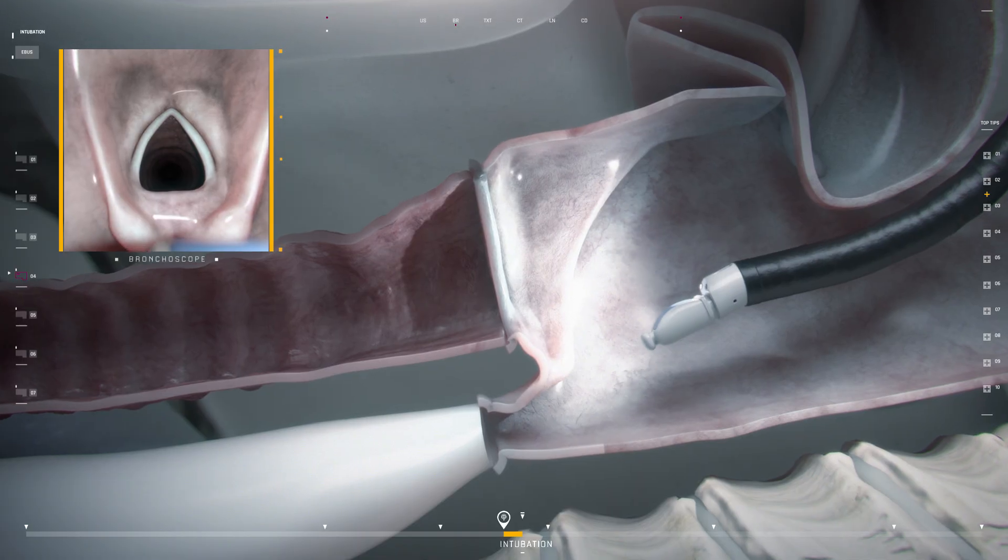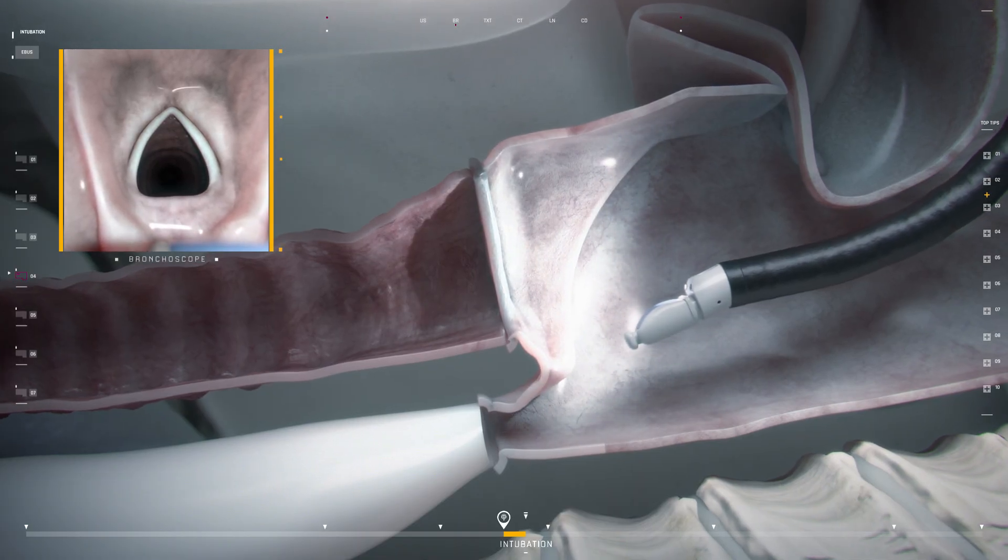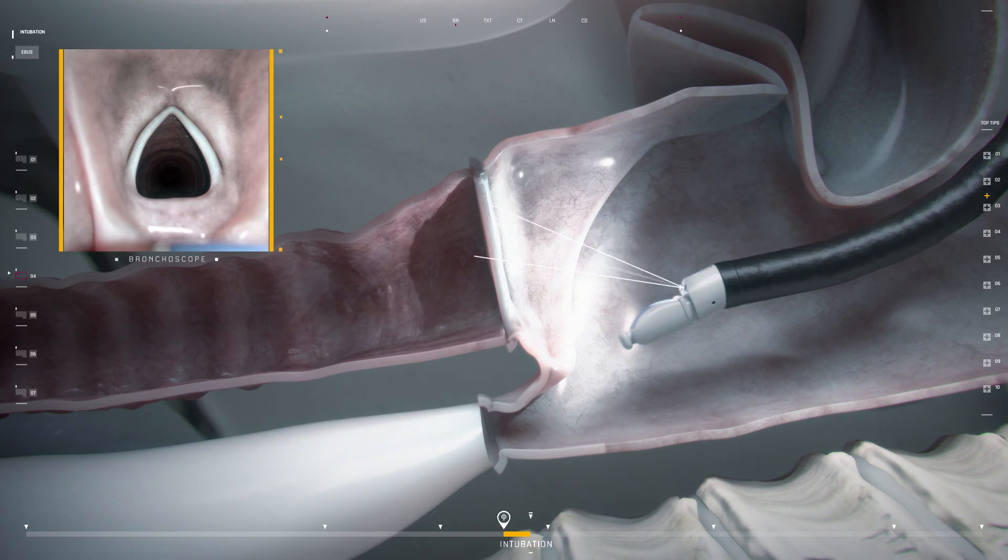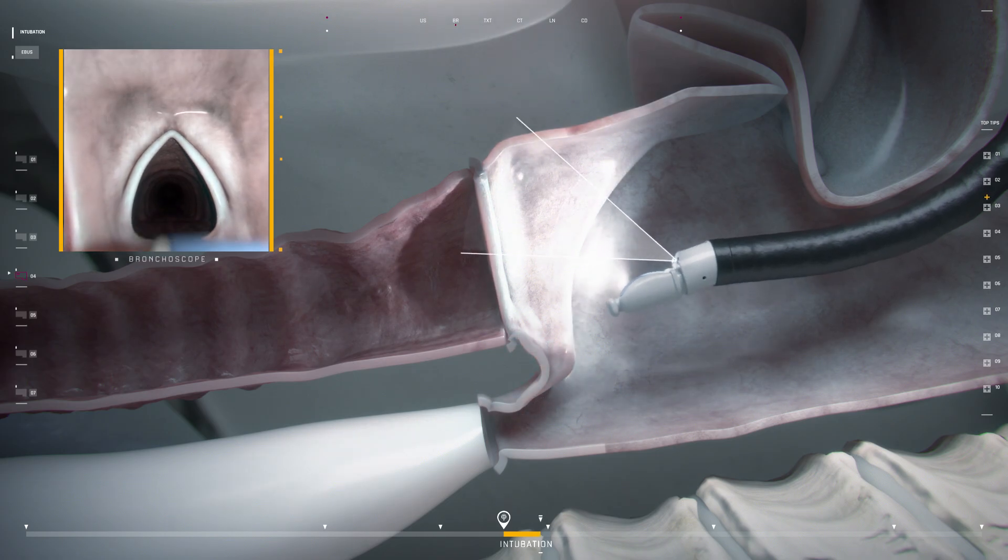As the bronchoscope approaches the cords, remember that the tip of the EBUS scope lies below the forward view of the scope. Thus, when traversing the vocal cords, the scope must be flexed to allow the tip to pass over the arytenoids and into the upper trachea.